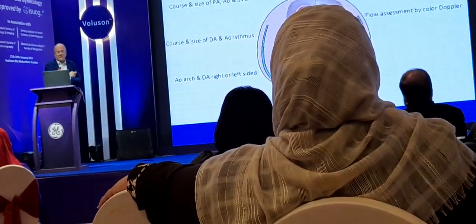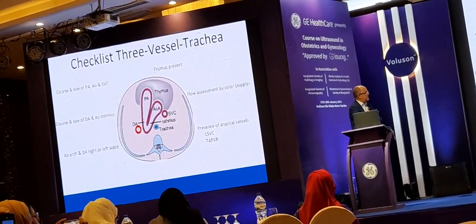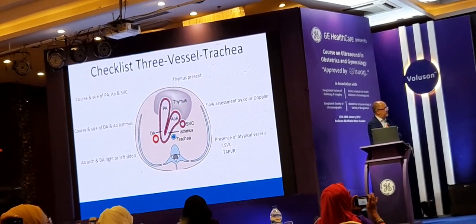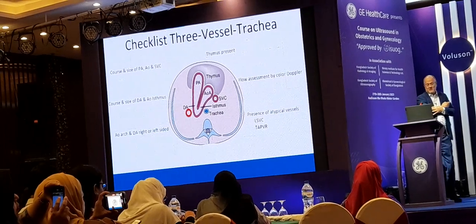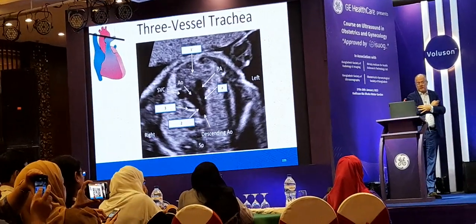Thymus is present in the front. You do color assessment by Doppler, as we've seen previously, and you make sure that you don't have any atypical vessels like left SVC or total anomalous pulmonary venous return.